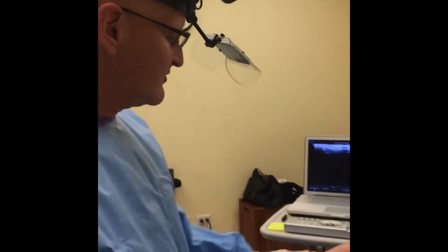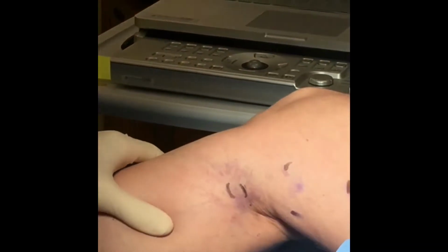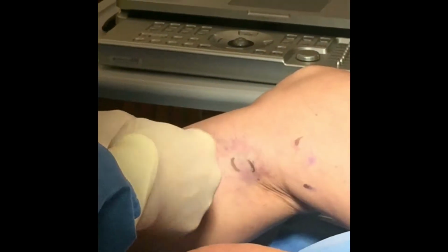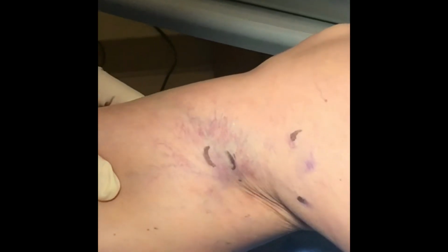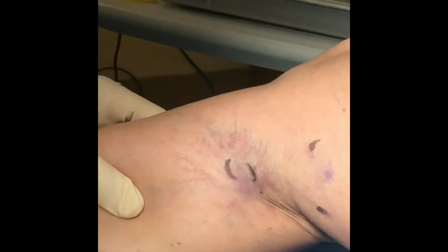Speaking of cool, right here we have a dense patch of spider veins. So here we have a very interesting case. We have a classic blush of spider veins on the inner part of the knee. And what many people might do is just treat the spider veins directly. That would be a mistake.